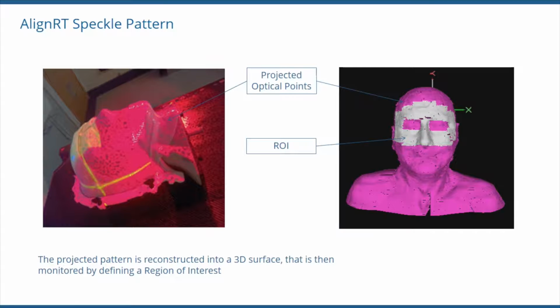The ROI is drawn around the isocenter or region we wish to track, and we'll use this portion for positioning and monitoring during treatment. The software will perform a nearest point match of the 2 surfaces, and the registration will provide the offsets or delta values. Multiple regions of interest can be used for the same setup also. For example, in a bilateral head and neck, when you want to position each shoulder independent of one another, and then you can switch to another region of interest for final positioning and monitoring during treatment.